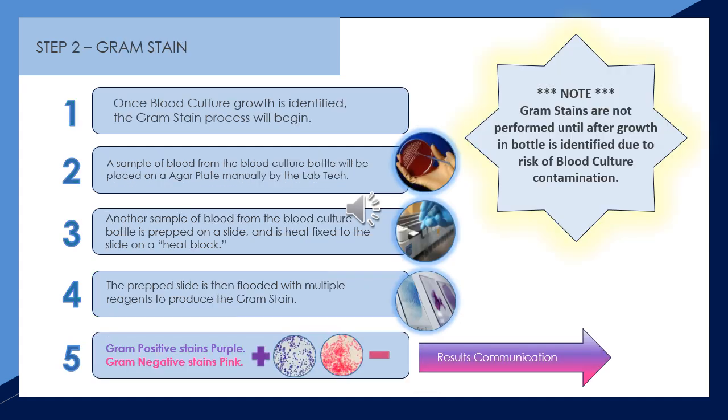Step 2 in the blood culture process consists of the gram stain. Please note that gram stains are not performed until after growth in the bottle is identified due to risk of blood culture contamination.